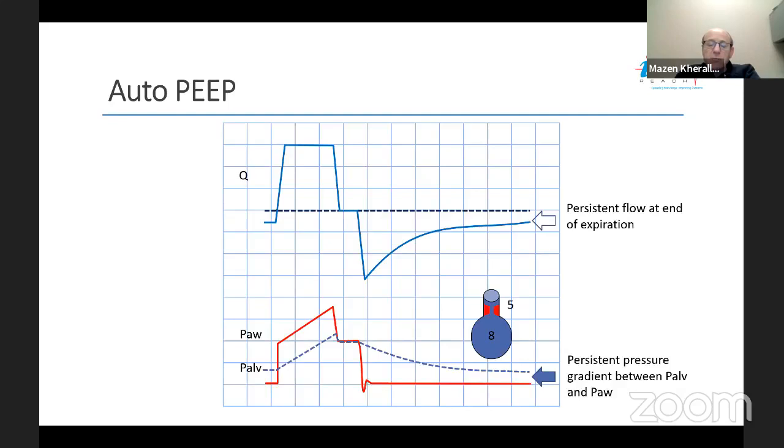You know, tidal volume that is set on the machine in volume control mode of ventilation is determined by the operator, and in pressure control mode of ventilation is determined by the lung mechanics. So, but paradoxically might decrease if it is due to stiffness of the lung.